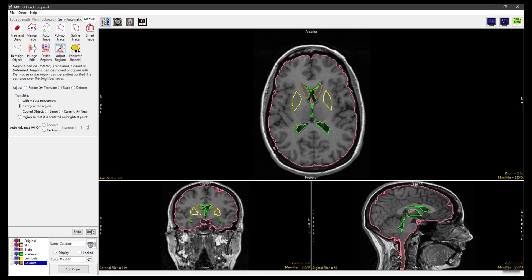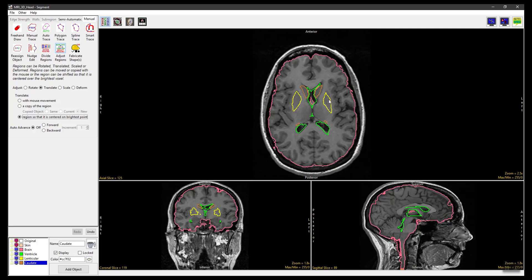The Translate Adjust method also allows you to translate the region so that it is centered on the brightest point. With this option, the tool calculates the brightest pixel in the object and sets that as the center of the object, translating the object appropriately. Set the Translate method to center on the brightest point, then click in an object. The region will instantly be re-centered around the brightest point in the object.